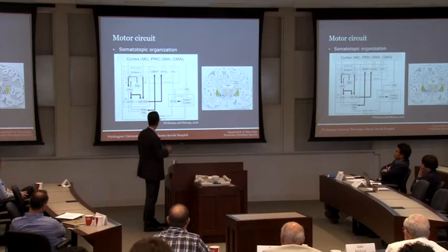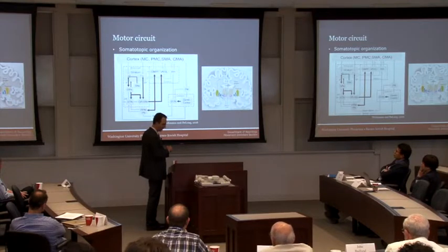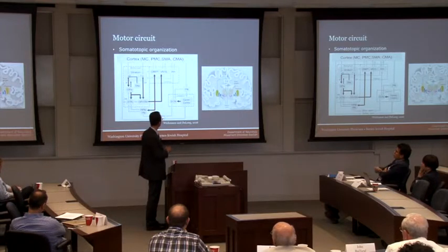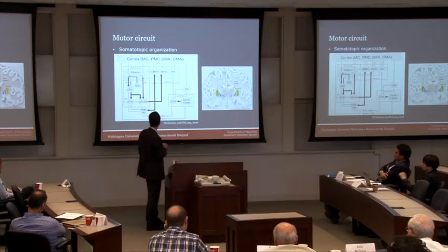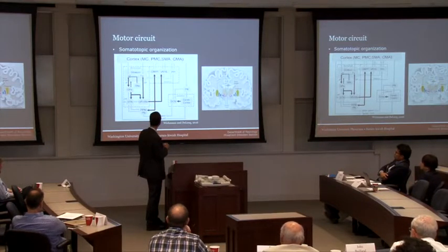Grossly, the cerebellar thalamo network seems to be most involved in tremor. Stimulating the output nucleus of the cerebellum, or the output relay in the thalamus, really seems to benefit tremor, and that's our target. This is our target for essential tremor. But thinking about Parkinson disease, patients with Parkinson disease who have a rest tremor, stimulation of this also benefits that rest tremor as well. But more importantly in Parkinson disease is the network over here, the cortex stimulating the basal ganglia.